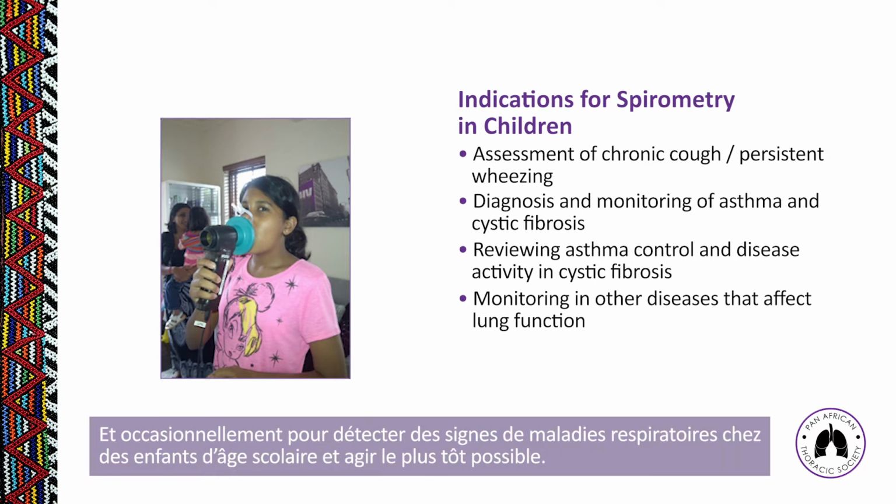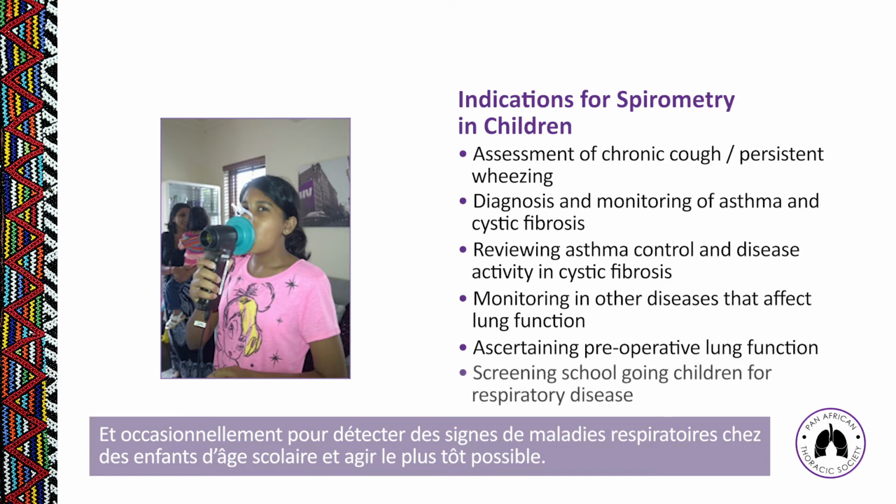We would also use spirometry in children to ascertain preoperative lung function, which is what we've already mentioned in adults as well. And then sometimes school-going children are screened for respiratory disease so that we can pick up respiratory disease early and take the steps to prevent any problems.